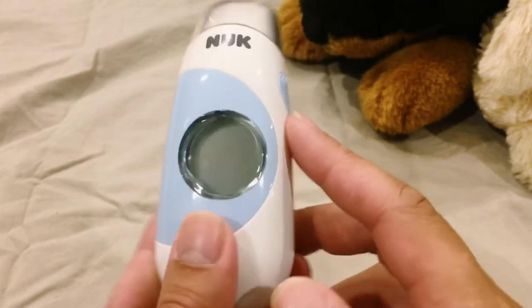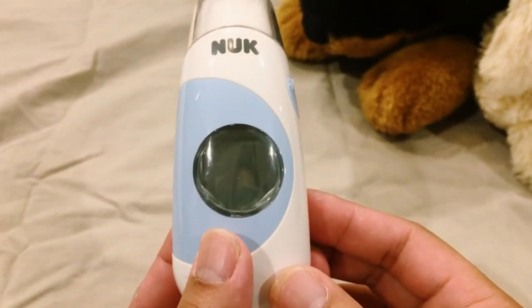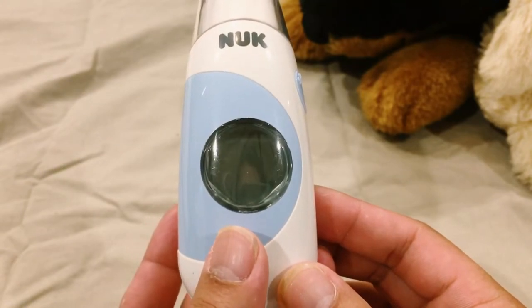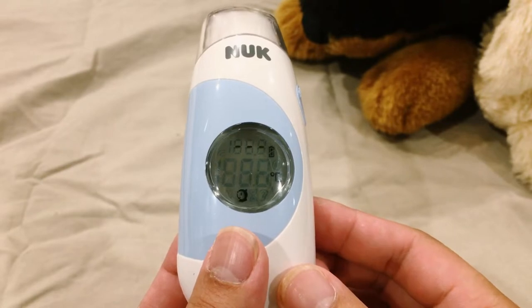There is a scan button on the side and an on and off button on the back. Press the on and off button once to turn it on. Once it's on, you can see the forehead icon on the screen.